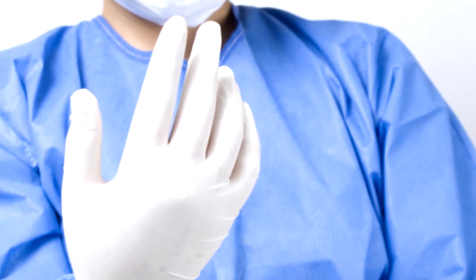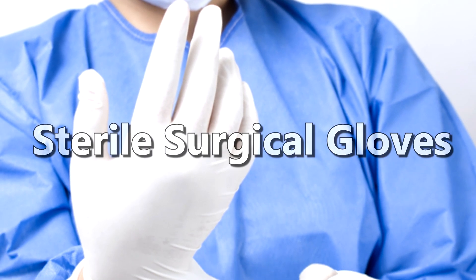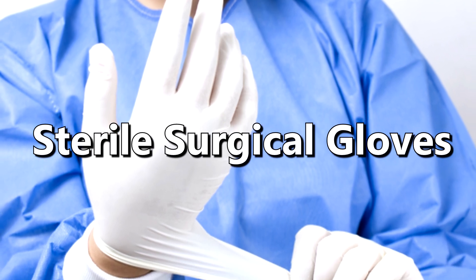In today's video we will see how to put on and remove sterile surgical gloves that are worn before surgeries and some other procedures.